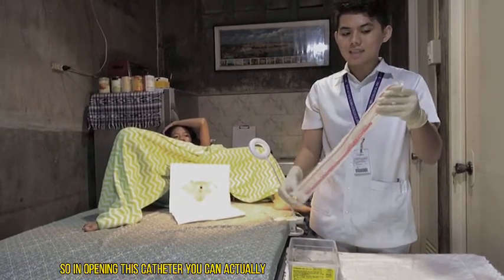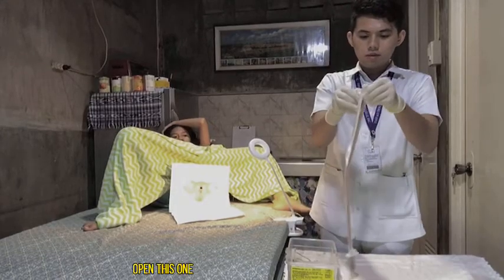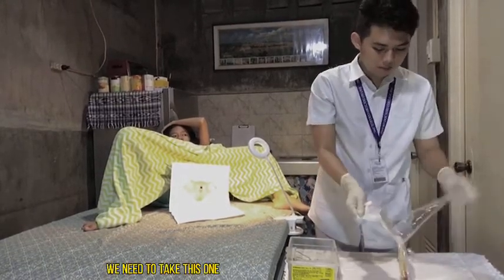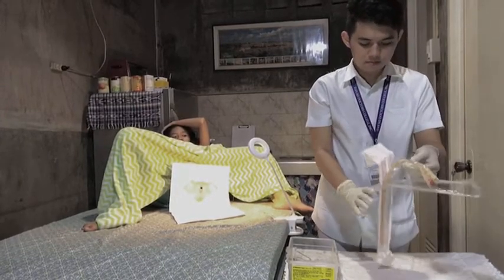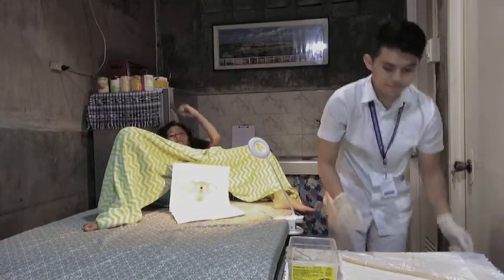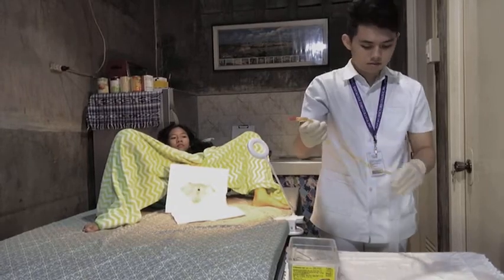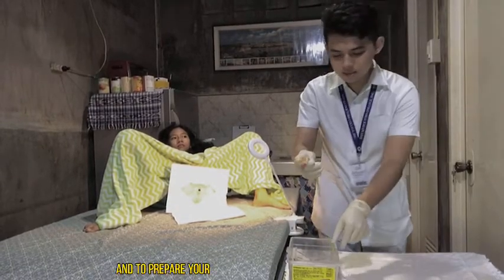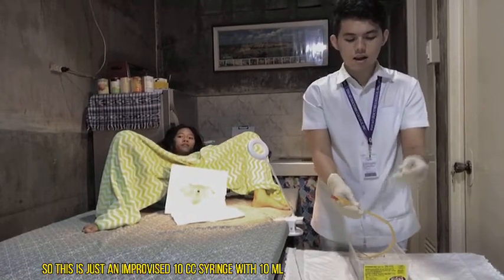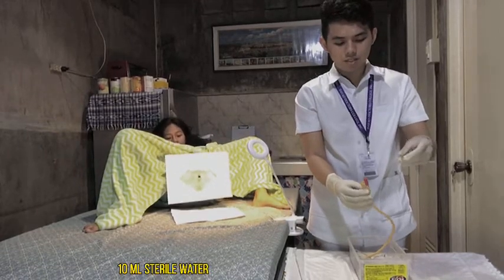So in opening this catheter, this is just like a gloves. Open this one. And drape this one. Cord. Open again this one. And to prepare your syringe. So this is just an improvised 10 cc syringe with 10 ml sterile water.